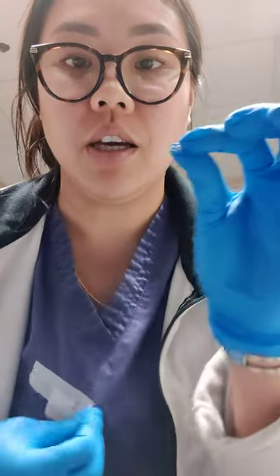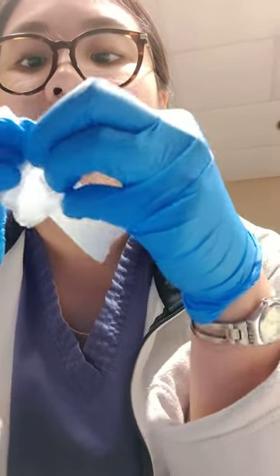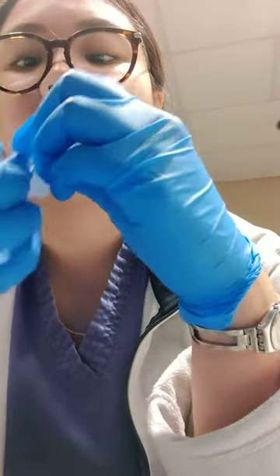Or like if there's a bump here or a cyst in the chest. Last time this lady had a cyst that was removed, and it's good to let the doctor know where it's at, and I just taped it over the shirt like that. So you could do the same thing with the BB. Just tape it the way it was and then put on another tape and then mark it.